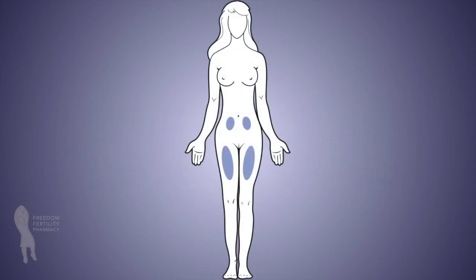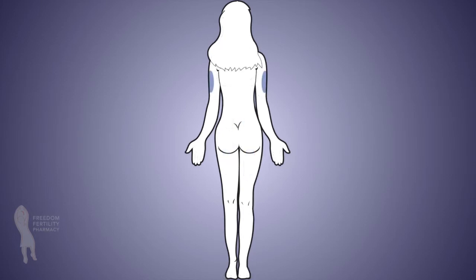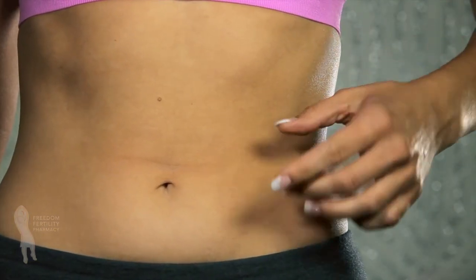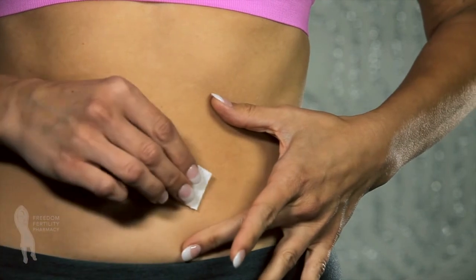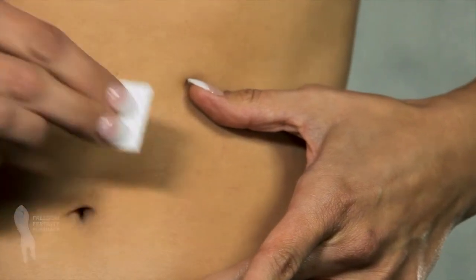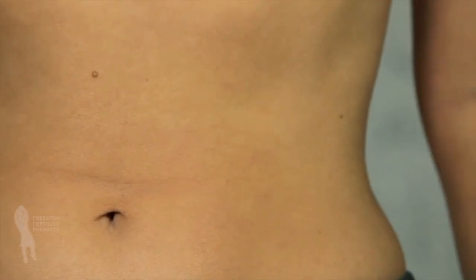Choose an injection site as directed by your health care provider. Common sites for subcutaneous injection include the abdomen, top part of the thigh, or back of the arm. For this injection, we will be demonstrating using the abdominal site. Clean the injection site with an alcohol swab and allow to air dry. You should alternate injection sites each day.